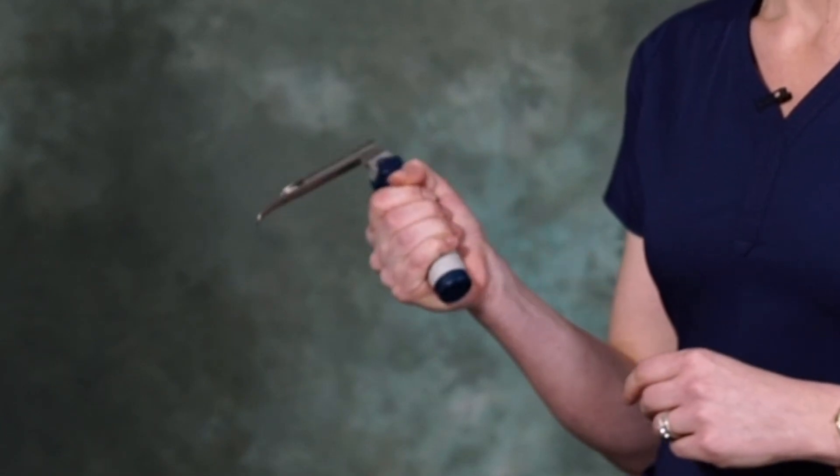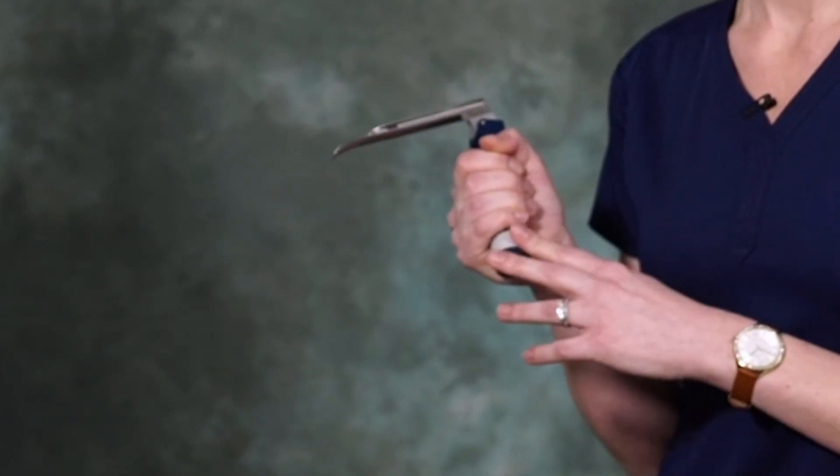Since this device is single-use, you're avoiding the risk of cross-contamination. Additionally, there are significant cost savings to be had because the cost to re-sterilize a blade and handle is greater than the cost of a single disposable laryngoscope. Thanks to the ergonomic soft grip handle design, this ensures that users of all hand sizes can firmly grasp and use this device.